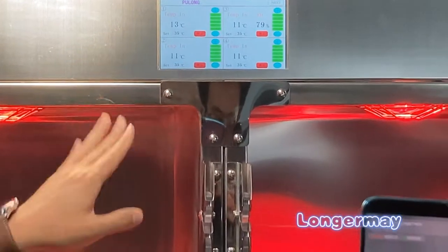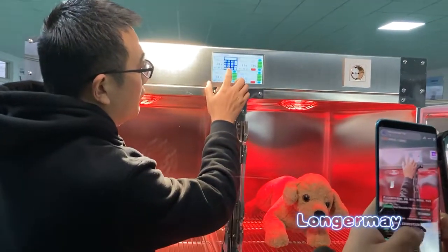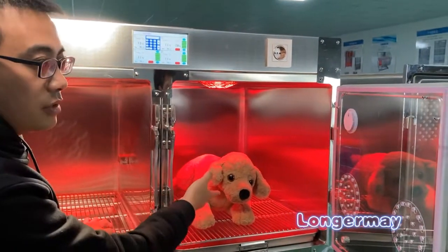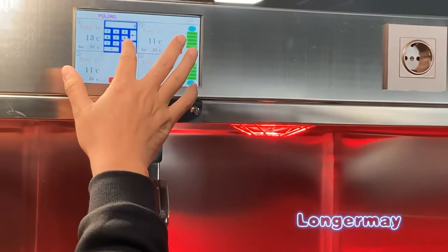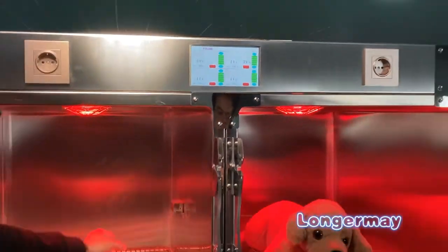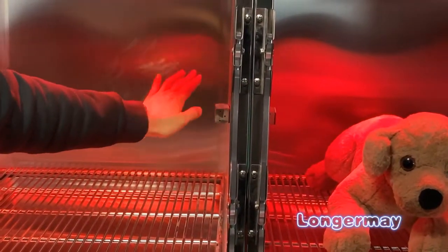And this one is just for the infrared light. And also for the degree, we can set the appropriate degree for different pets, like dogs or cats. You can set about 28. You can see this part. This part is the heat for the temperature.